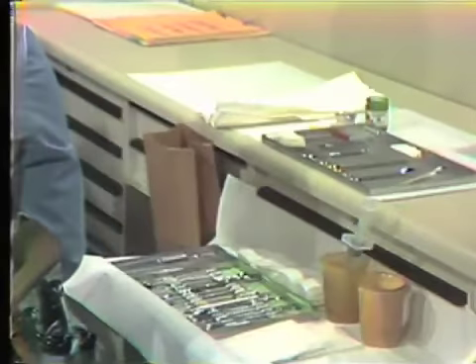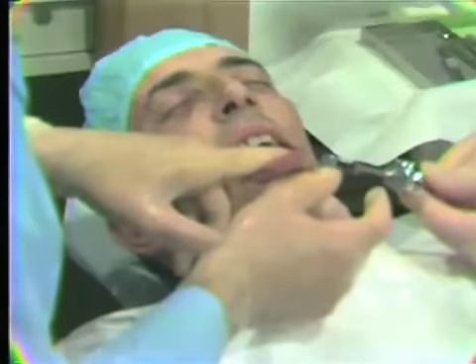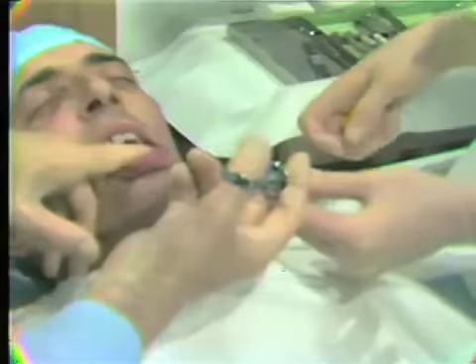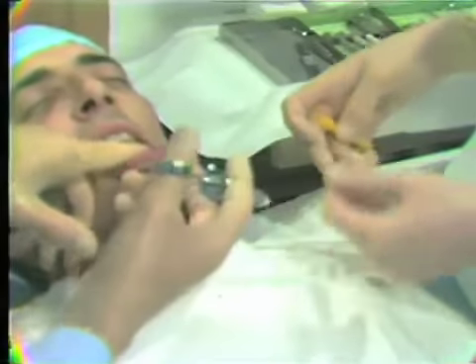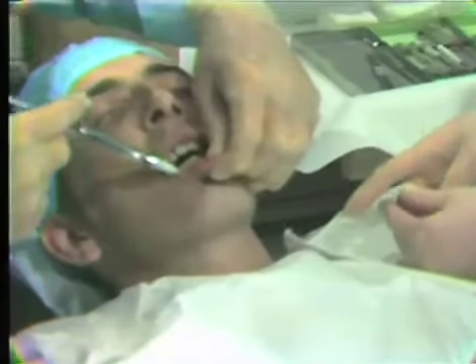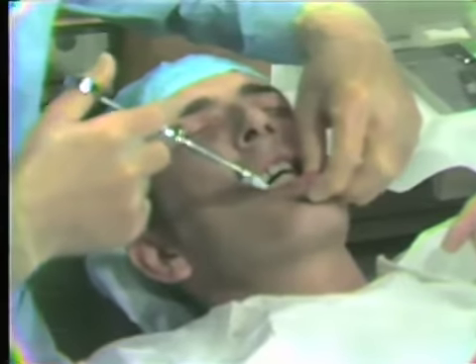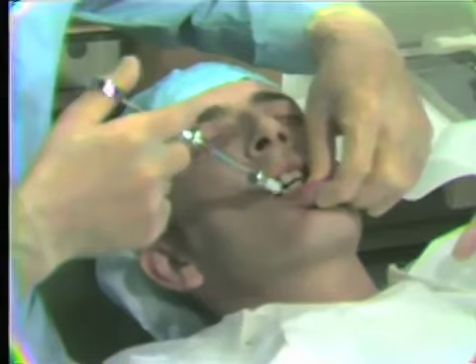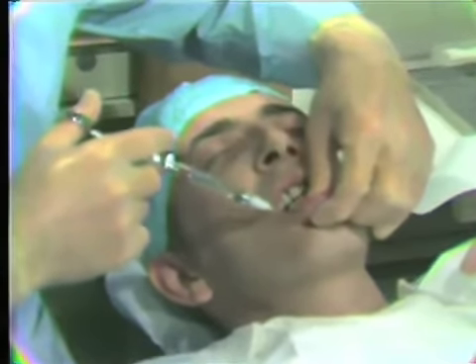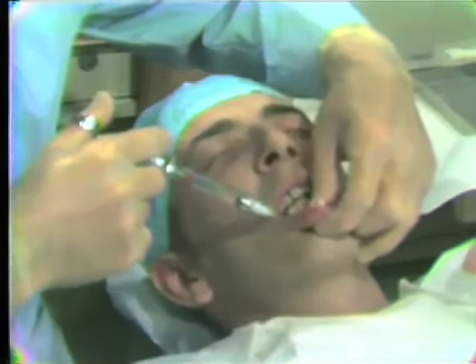As you note in passing the syringe, the assistant is holding the barrel of the syringe with her fingers covering the plastic cover for the needle. She places the syringe over my thumb, and we're able then to make the transfer very nicely. You should have noted that the exchange of the syringe occurred to the left of the patient's chin, out of the patient's line of sight, and away from the face area. We will inject around the mandibular anterior teeth and wait a few moments for the anesthesia to become effective.